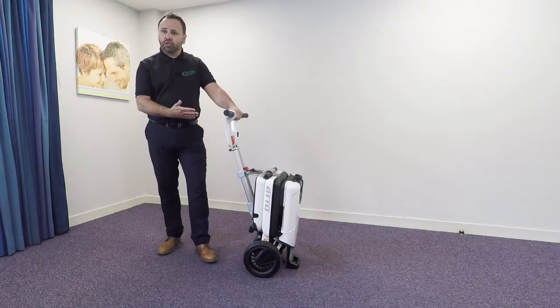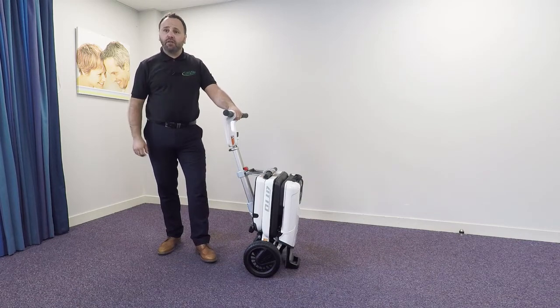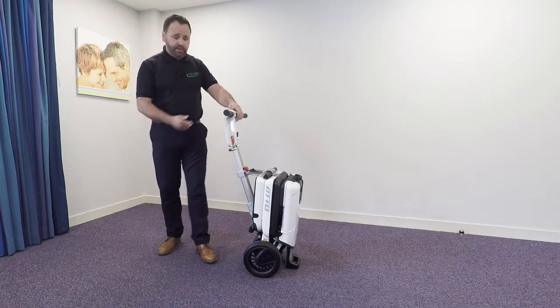Not only is this a folding scooter, the scooter actually splits into two sections as well, just to make it even lighter for getting in and out of your car. Let me show you how easy this is done.